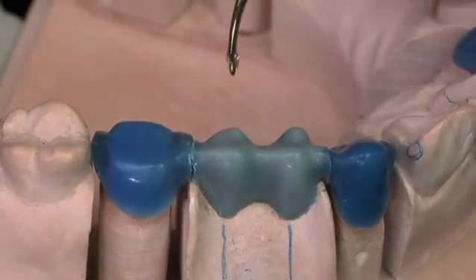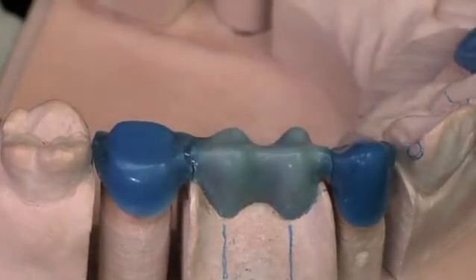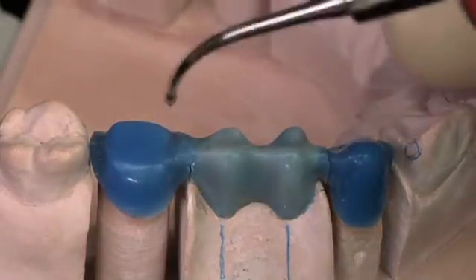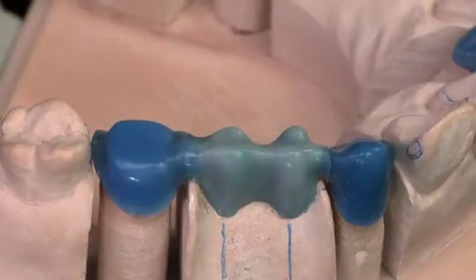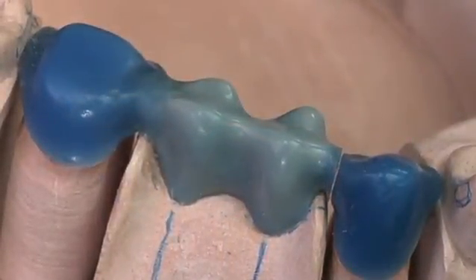I'm going to pick up a small droplet of wax and just put it right over the connector. Let's go down the facial with just a little bit more. So I've waxed over the cut that I made to free the pontic from the abutment, but I have not melted the wax of either the abutment or the pontic itself. I've covered one connector and left one open.